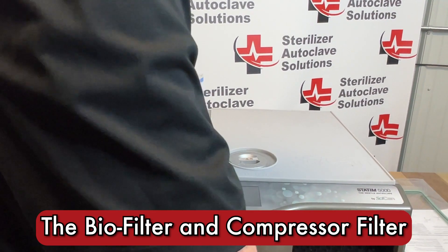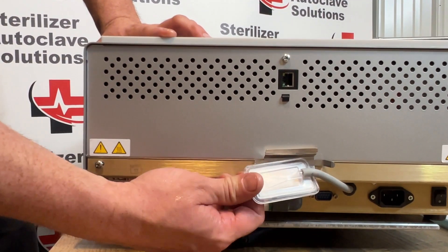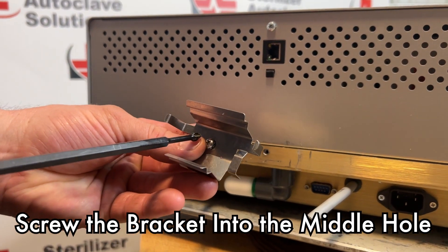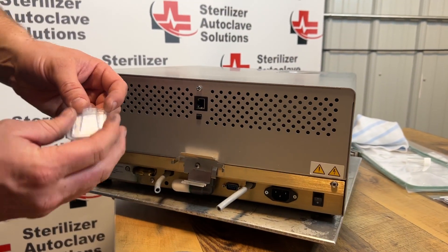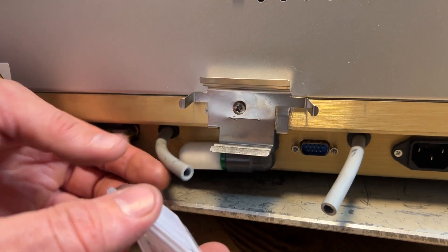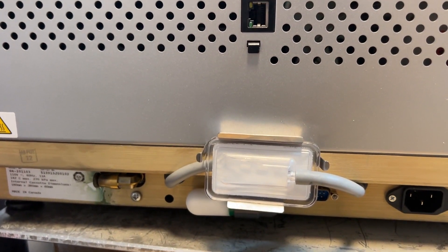We're going to move on to the back of the unit. At the back you have your biofilter — we are going to remove that. I'm going to start with our biofilter bracket with the screw in the middle. You might have to maneuver the cover from one side to the other. We are going to change our biofilter. There is an arrow on our biofilter bracket as well as on our biofilter. Slide that back into place — push up on the top and it will simply snap into place.